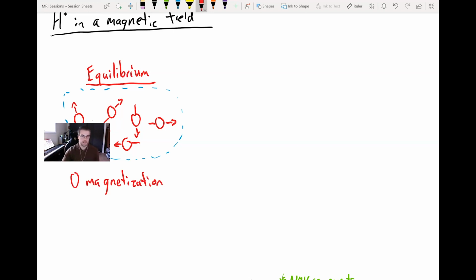But because these magnetic fields are oriented randomly, they essentially all cancel each other out, like these 2 that I happen to draw in exact opposite orientations. If you add those 2 magnetic fields together, they cancel each other out, so there's nothing there. Oh, actually, it looks like I drew them all fairly opposite, so nailed it.